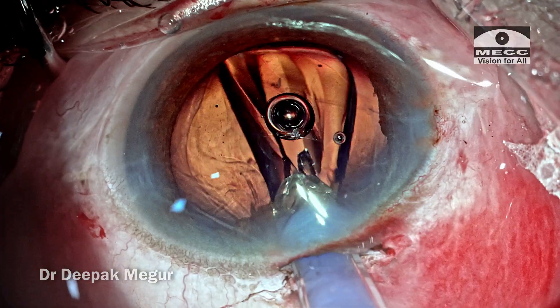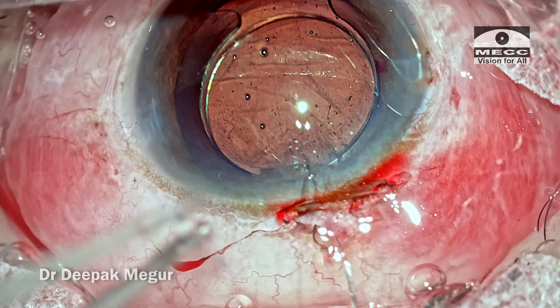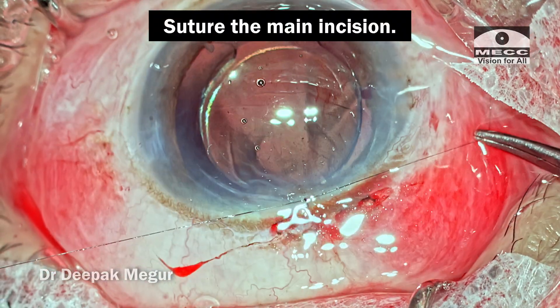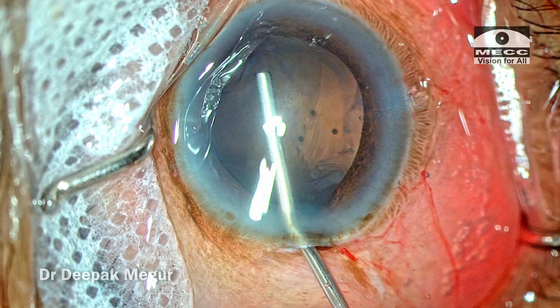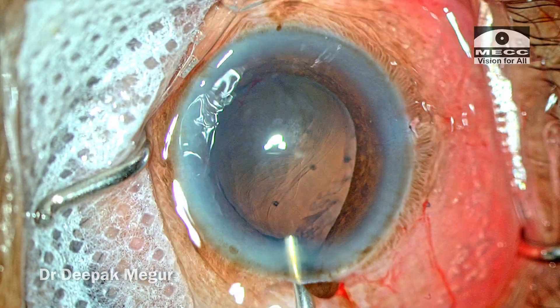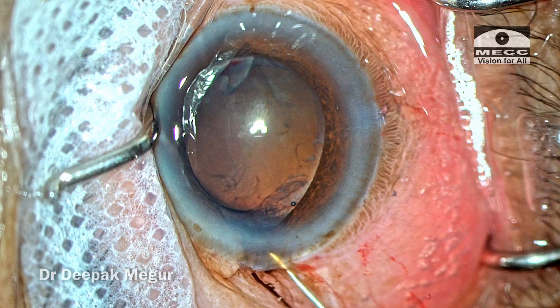The phaco is completed, the lens is placed into the bag, and a single interrupted suture is used to close the main incision which was not appropriately created. This is a similar case wherein the iris is prolapsing out and the young surgeon is trying to push it back — it doesn't work.